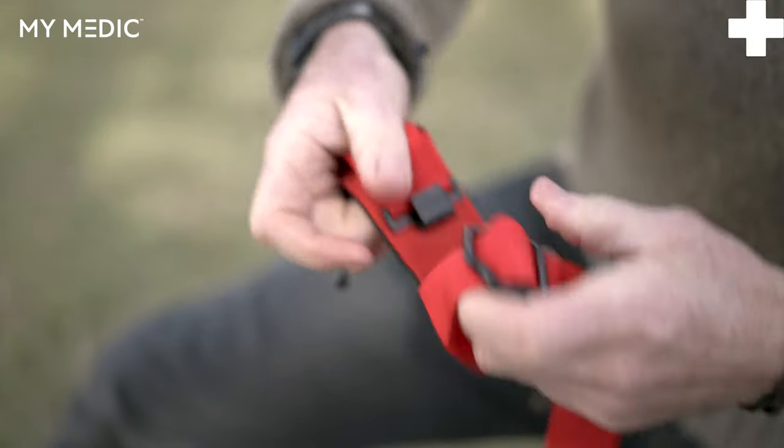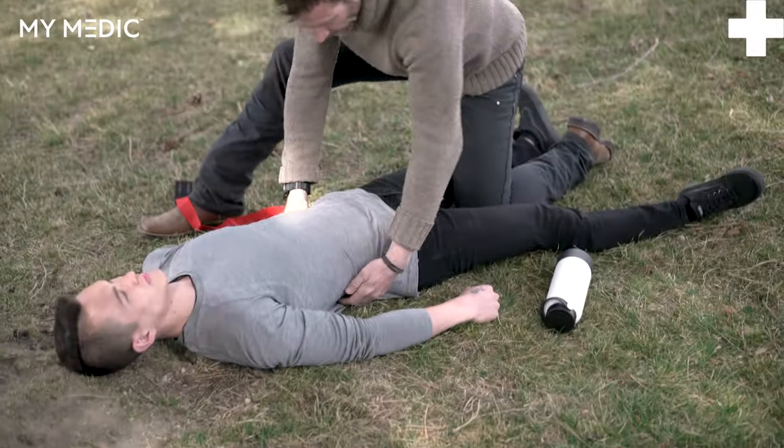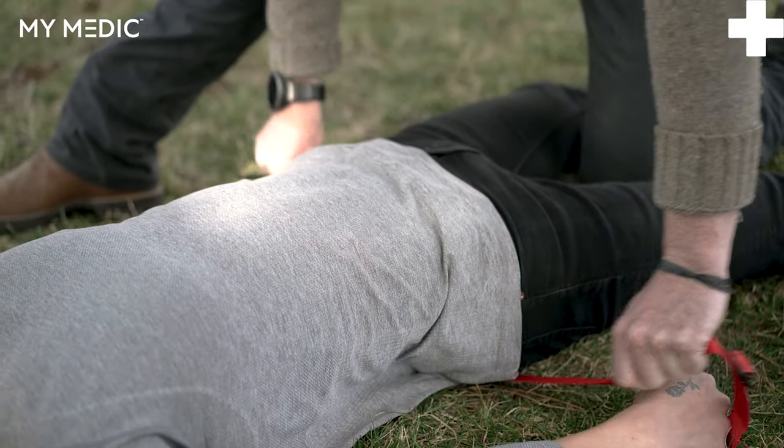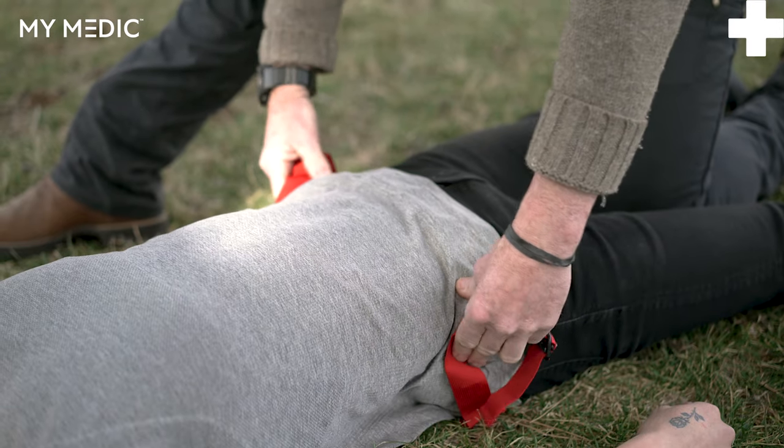Go ahead and unbuckle your tourniquet and run that buckle all the way out. Take the tail and run it underneath your patient in a seesaw motion, getting the tail of that tourniquet situated just at the top of your patient's hip bones.